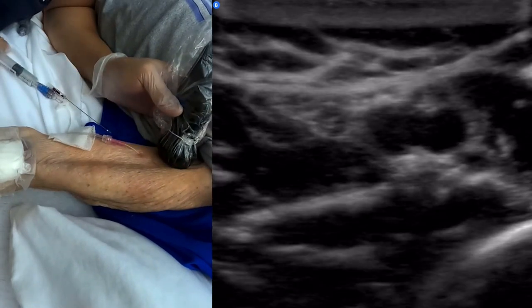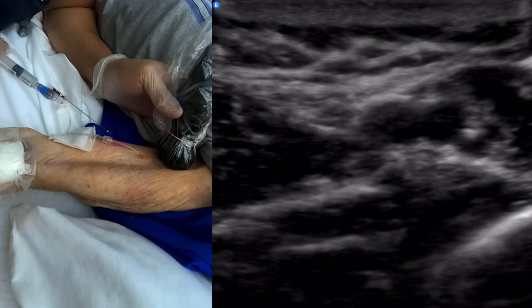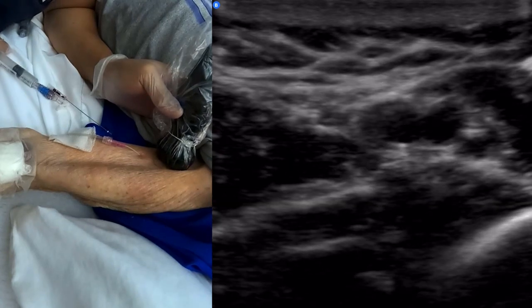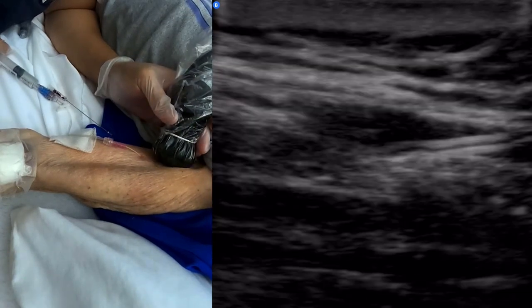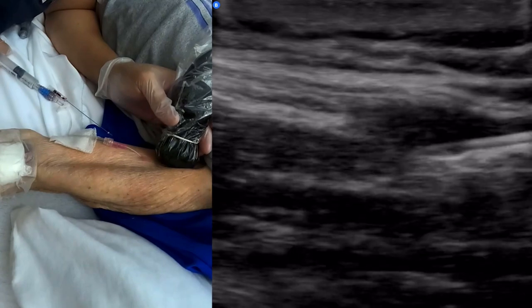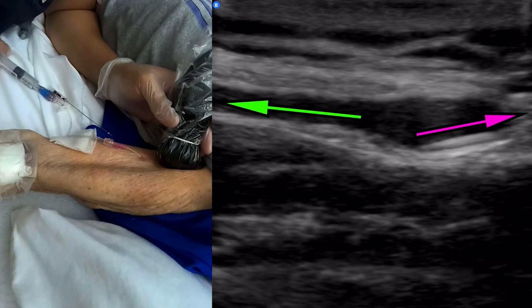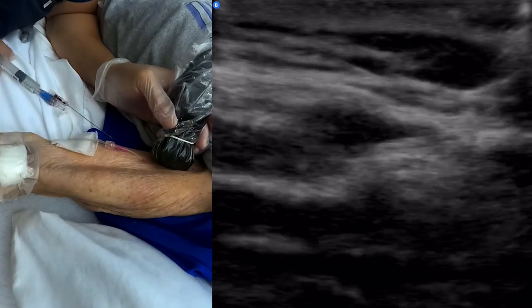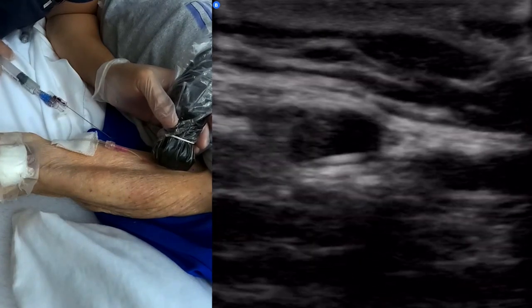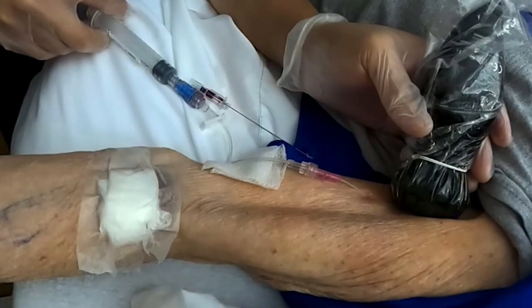I don't see any edema of tissue. I felt a little bit of a snag, and I was concerned for a second that I punctured through, but when I see the catheter, it looks like it's in okay. I'm getting good flush, I'm getting good blood return. So around there, see that hump, how it angles up? A lot more than the catheter is angled. And about a half cent. So I'm about 1.5 centimeters in. Got good flush. There it is. So it's in a good place. We're gonna keep it there.